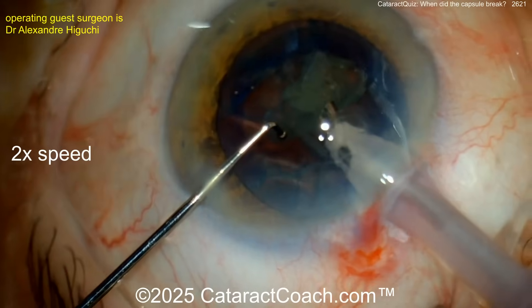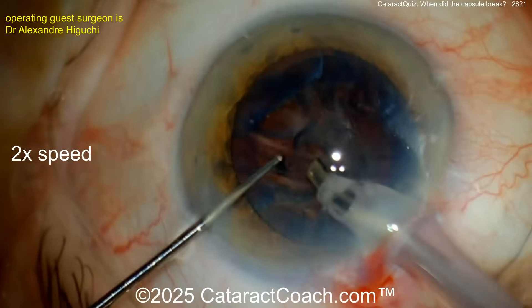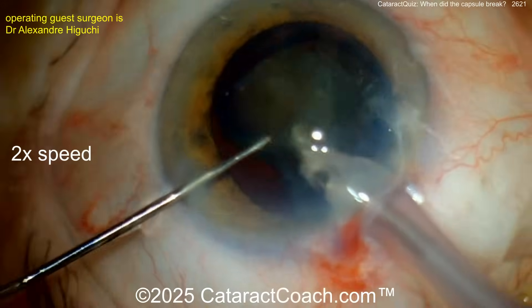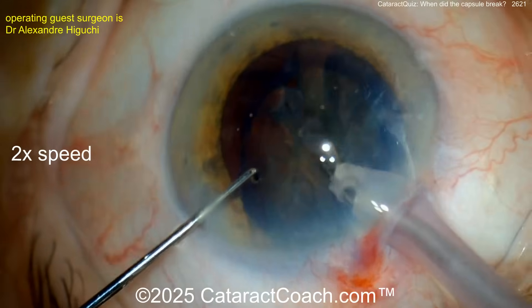Getting these pieces up — when will the bag break? Let's find out. At the end of this case, the capsule bag is wide open and you'll see why. Removing these pieces — let me know when you see something. Now the video is sped up, about two times normal speed.